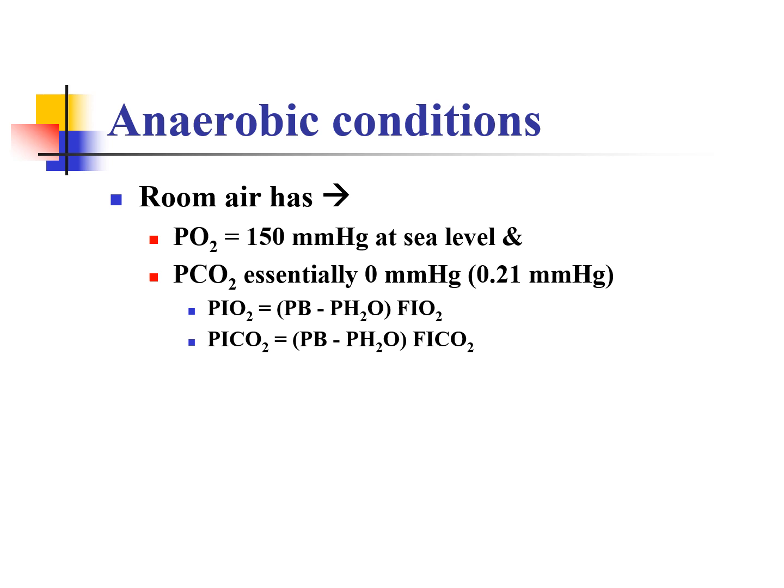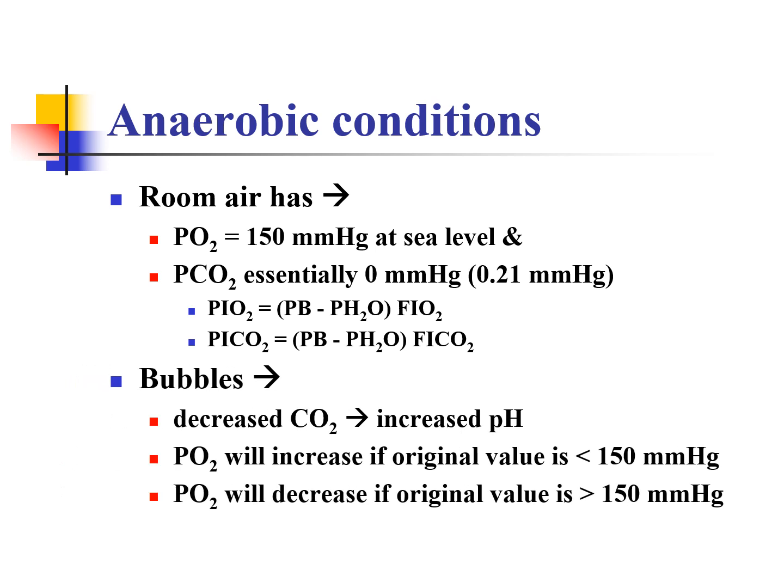So why am I talking about these? Well, there's an air bubble in a blood gas. If you do not aspirate any air bubbles out of the blood gas, after you've completed the gas, while you're holding pressure on the wrist, that will change things like the pH and the CO2 and the PO2 of the blood gas, which means those results aren't valid, which means we don't really know what's going on with that patient, which means you're going to have to go in and redraw it. So that's going to be a big deal.